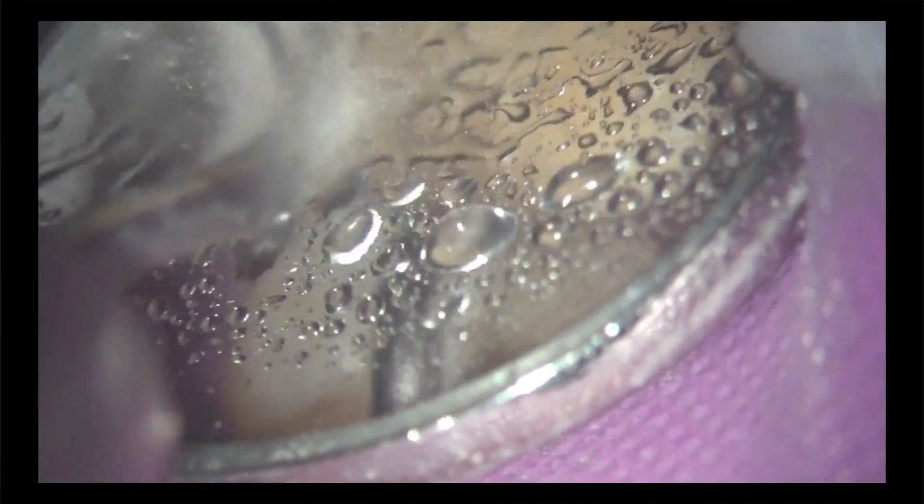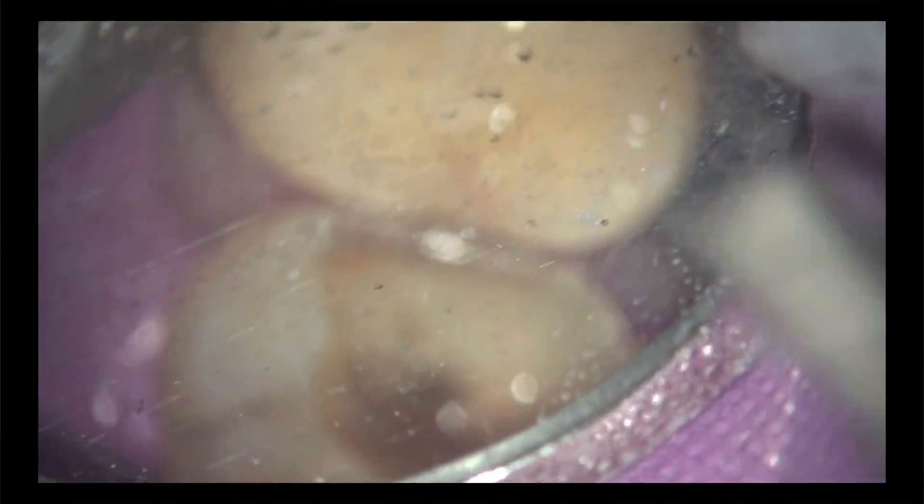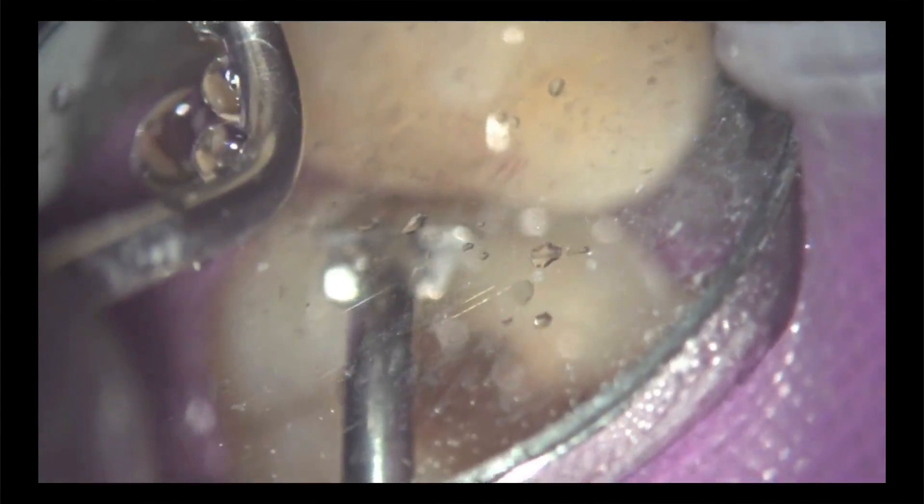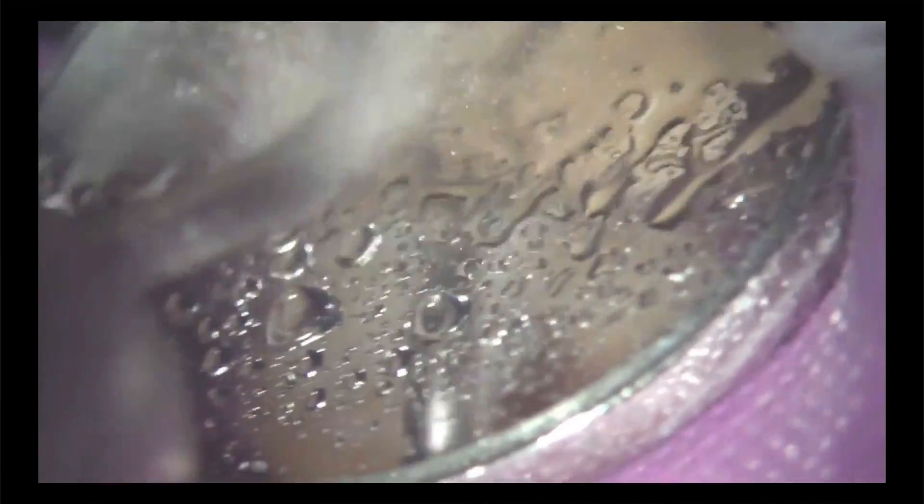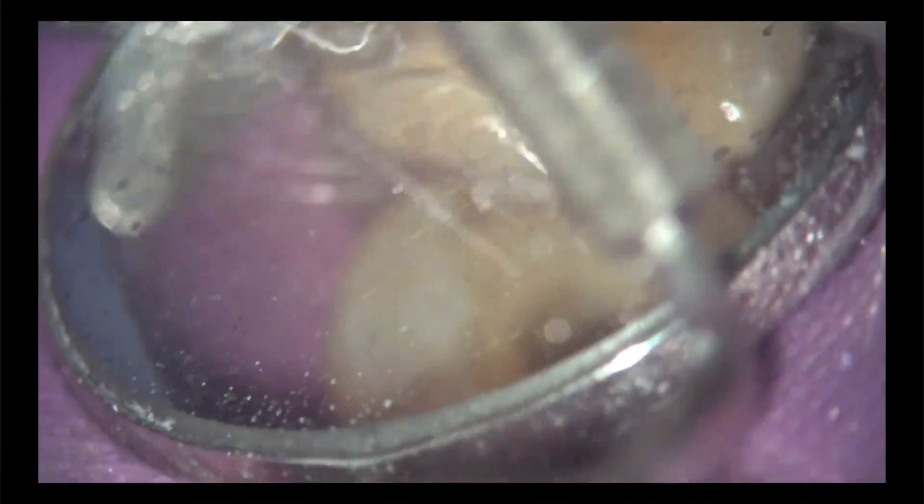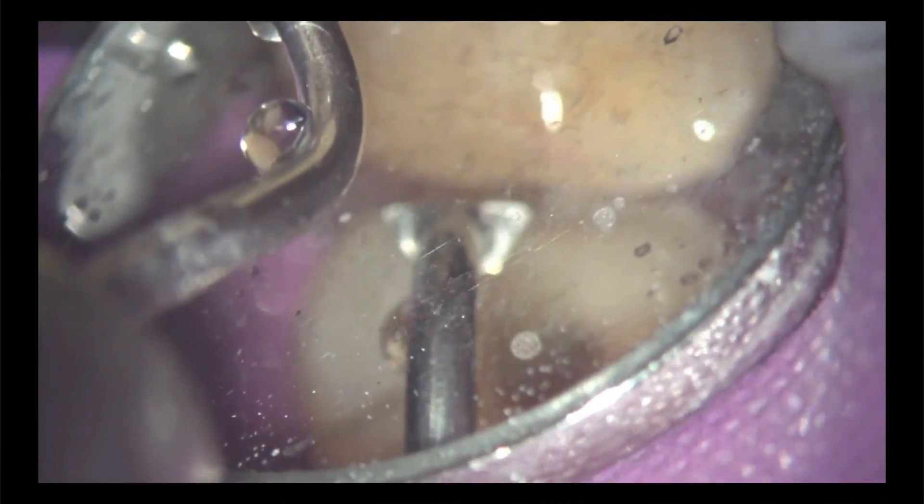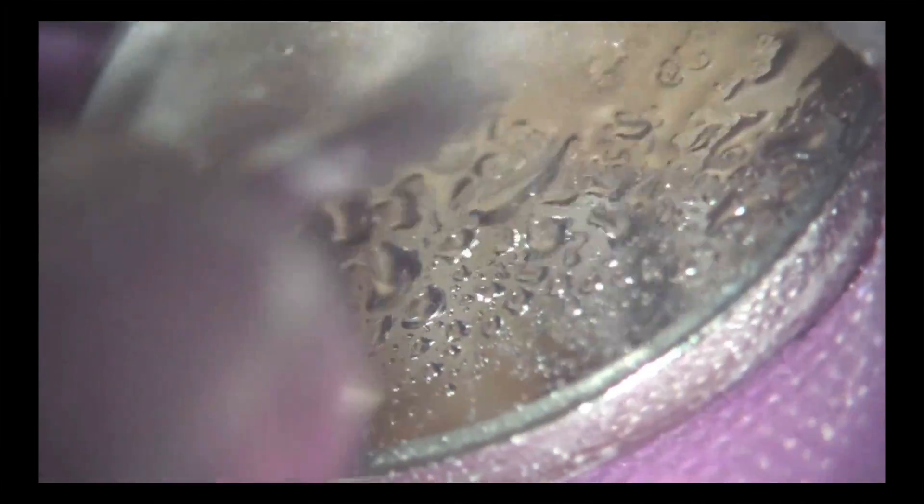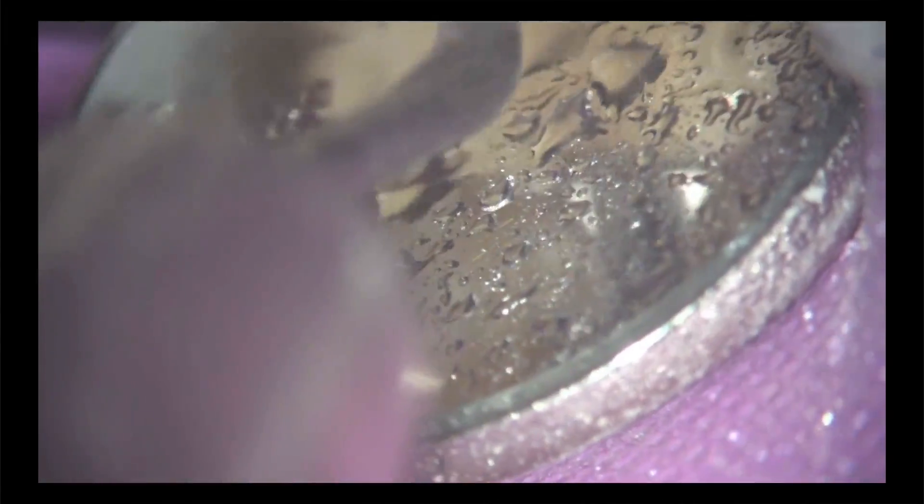So you can see, you can't see this perfectly, but you can see how I'm positioning this. And then we'll rinse the mirror off so that you can see. I'm going to change the mirror because that one's a little fogged up, but basically you get the idea. So here we are. We're just prepping this again. I'm going to change the mirror so you have a good view in a second. And this instrument just goes in. It doesn't cut super fast. It's not super fast the way it cuts, but that's a good thing because you're going for precision, not speed. So this isn't a bad quality to have. It's not as fast as a rotary diamond.